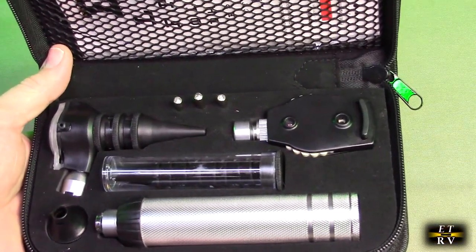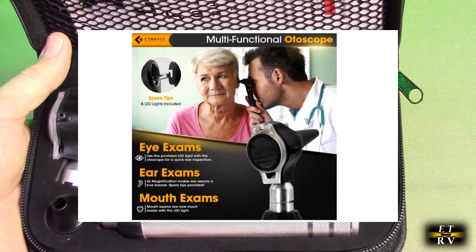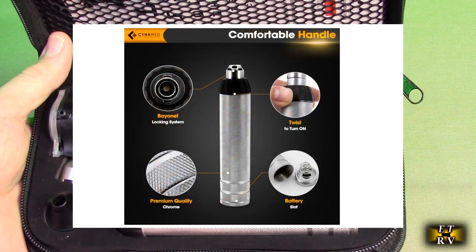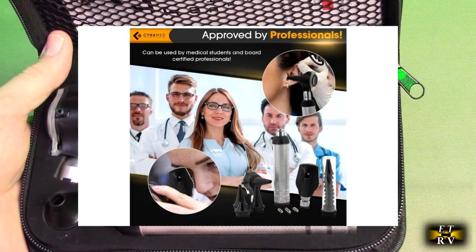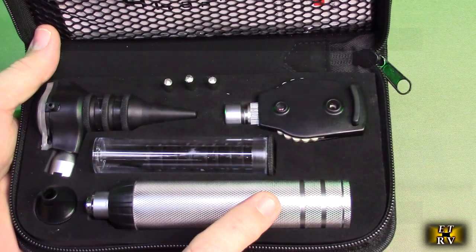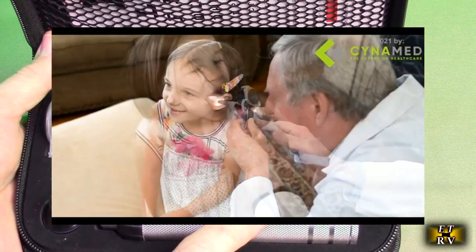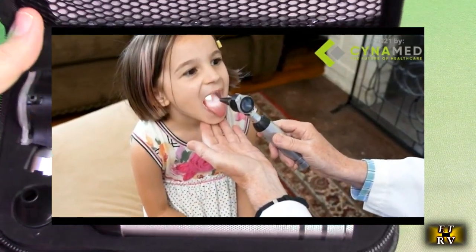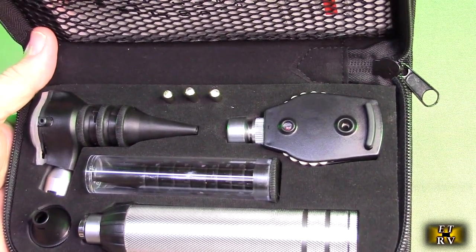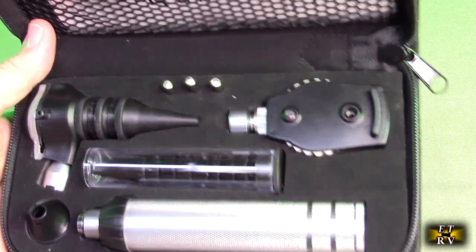This is an otoscope for ear and nose, and an ophthalmoscope for eye examinations. It can be used at home or by medical students, and has replacement tips in the carry case. It uses two alkaline C batteries that go into the base — real simple to use, no charging involved. This will allow you to perform medical examinations of the nose, throat, tongue, ears, and eyes.